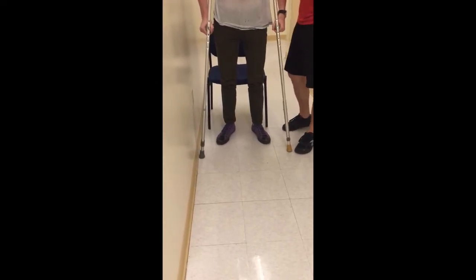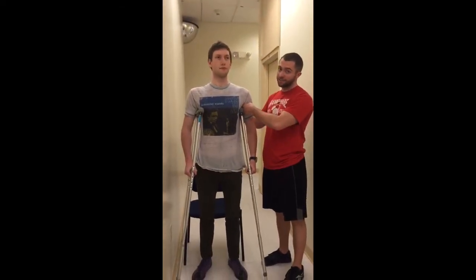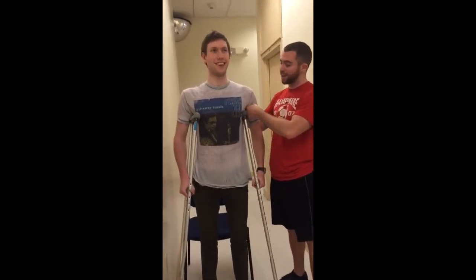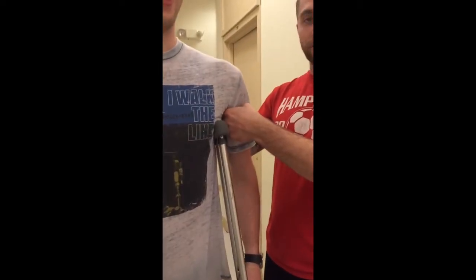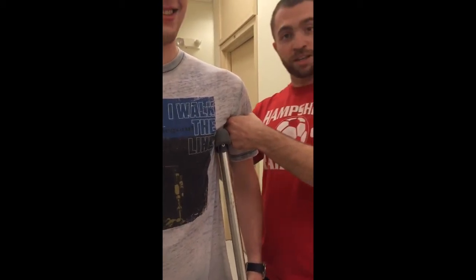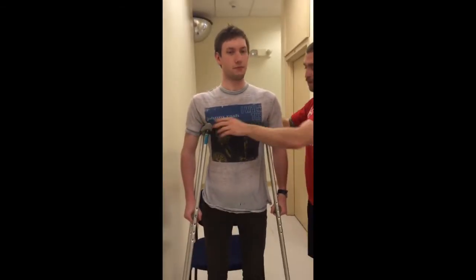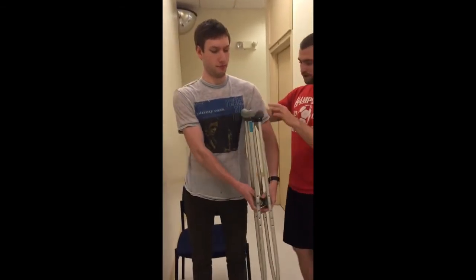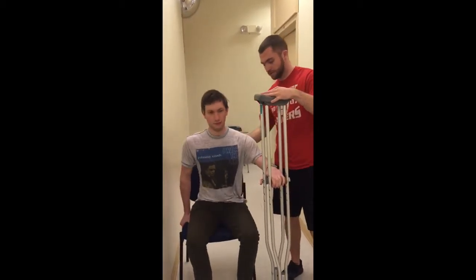So Will's going to be perfect. So now I'm going to stick my hand in his armpit, and you really got to get in there. I feel it. And you have to see if 2 to 3 fingers can fit in between the crutch and the axilla. Okay? In Will's case, it does, but we're going to pretend it doesn't. Okay? So great job, Will. I'm going to have you take that crutch, put it on this side, and we're going to sit back down. Nice and slow. Perfect. Great job.